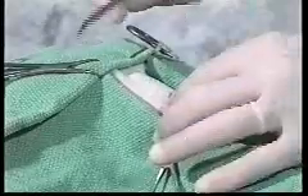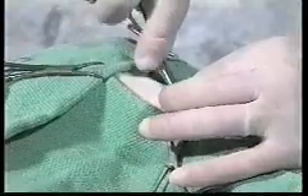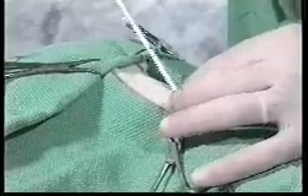Now we are going to take a hemostat and just open that incision just a slight bit to get into the sub-Q. With the tube-stylet combination in place, we are going to moisten that again and slip it through the incision.